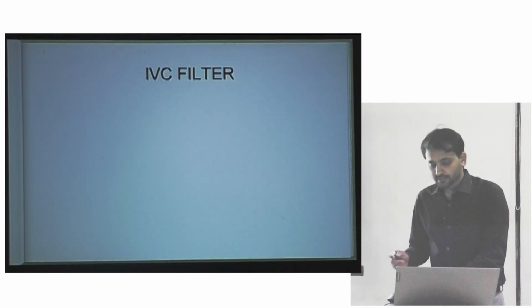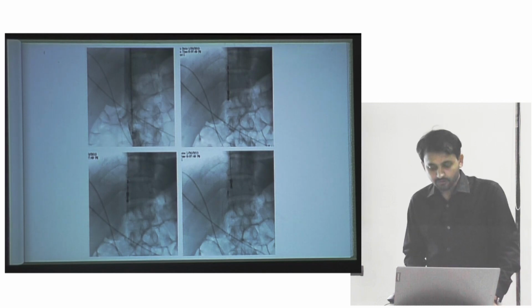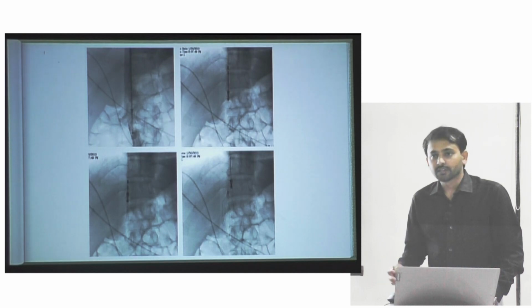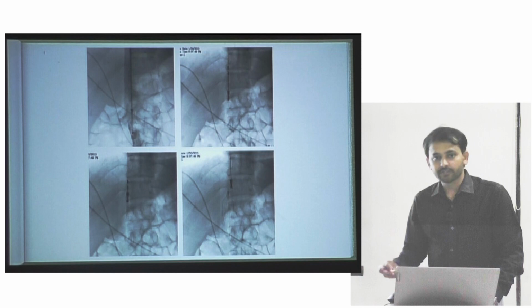So next, another common condition is DVT. Normally, first we follow a conservative approach for the initial 3 to 4 days, but once the patient is not responding or the limb is threatened, then we treat aggressively, and with the latest advancement in hardware, now we are doing it very aggressively.